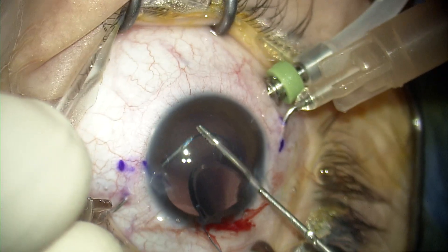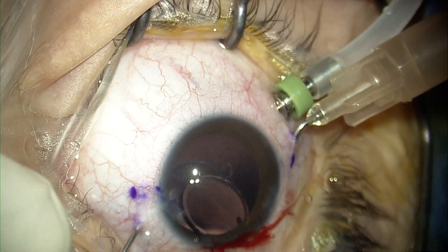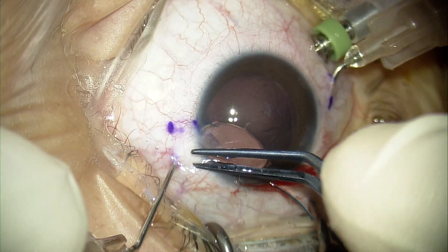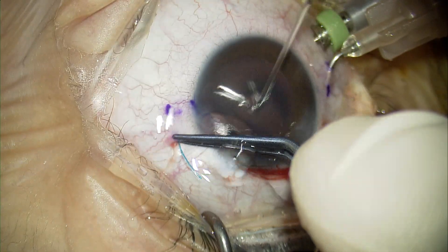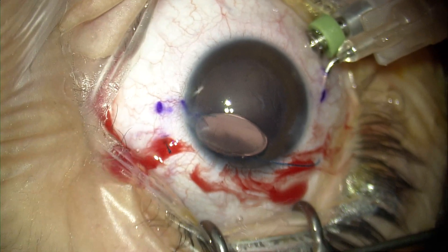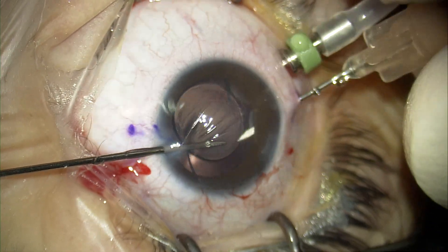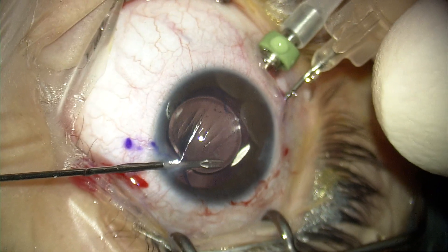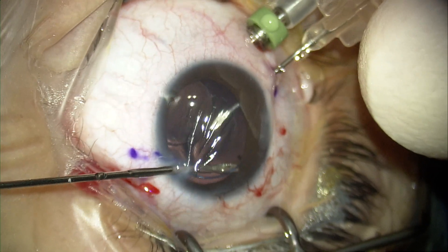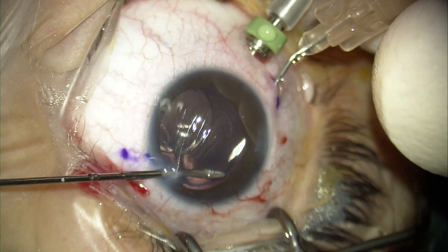One very important point in the Amani technique is really not to bring the haptic of the IOL to the needle, but actually to bring the needle to the haptic, in order to avoid excessive manipulation. A second key tip: you have to be ready with your grasping forceps — your McPherson or tying forceps — to immediately grab the exteriorized haptic. Then you apply heat to the tip of the haptic to create a small flange, which should fit through your sclerotomy track to avoid the haptic being exposed under the conjunctiva, as this can lead to conjunctival erosion and infection.